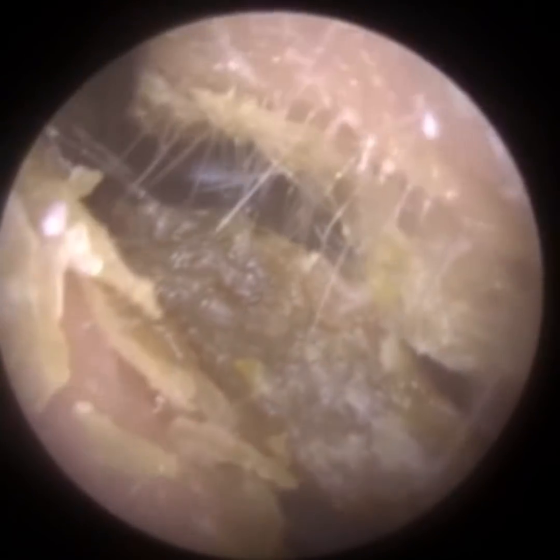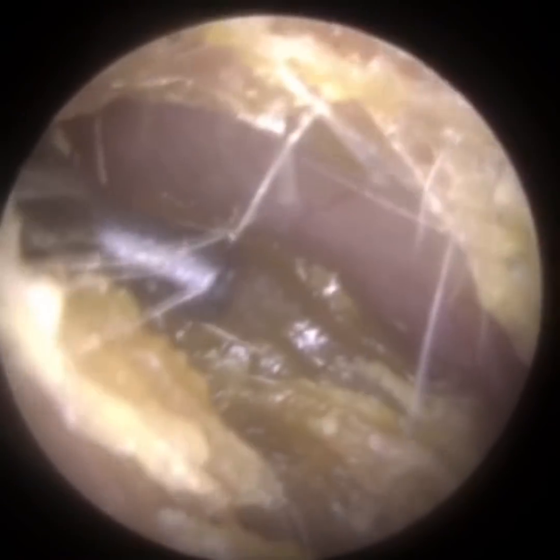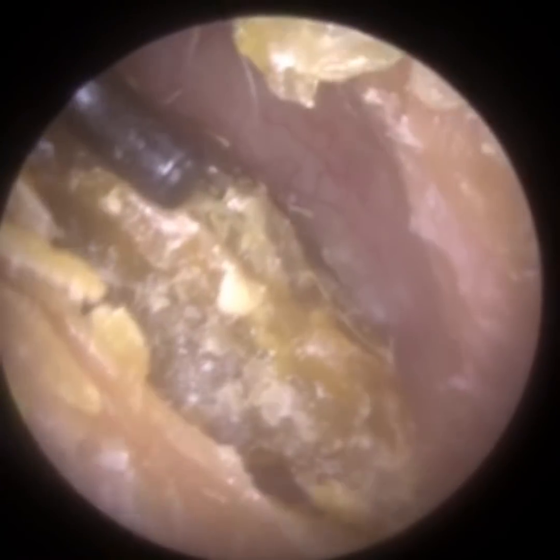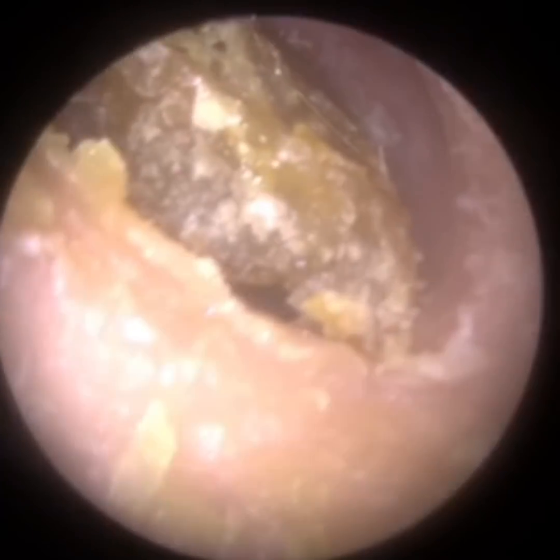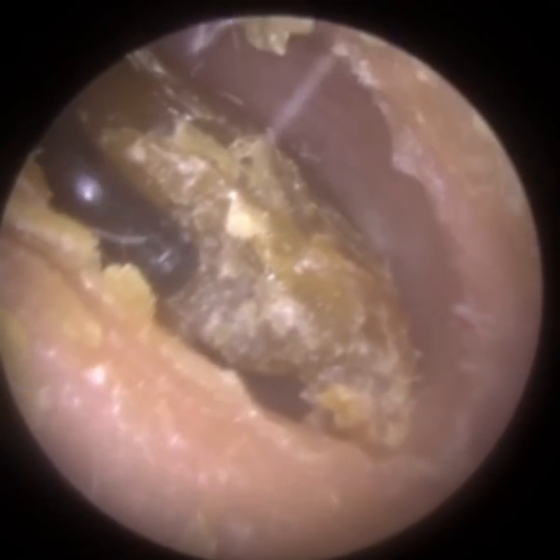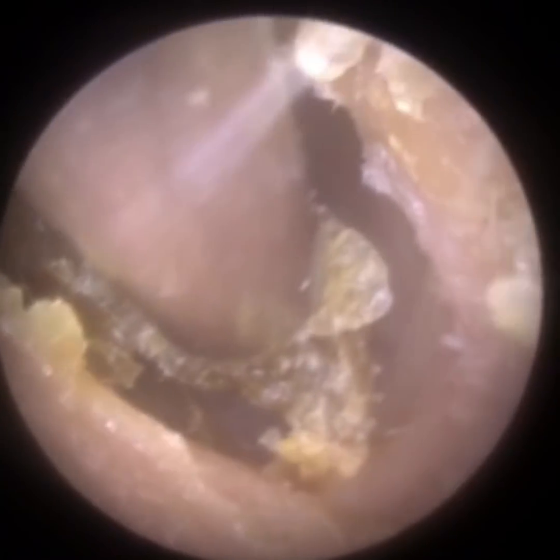The patient's got a very narrow slit ear canal. Most people's ear canals are oval-shaped — the height is greater than the width. In this patient's ear the height is significantly more greater than the width — it's more elongated and a lot more narrow, which makes it more tricky. I want to avoid, if possible, inserting the hook into the bony part of the ear canal, but there's a bit of a gap anteriorly and also at the roof, so I did attempt to get in and behind.